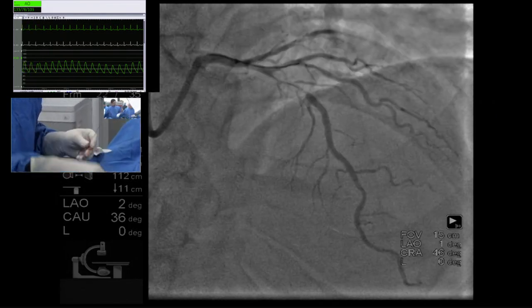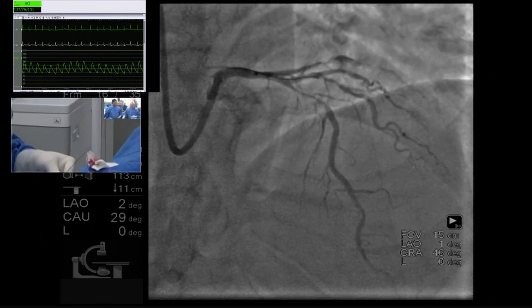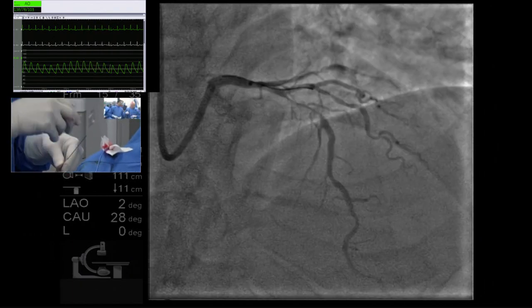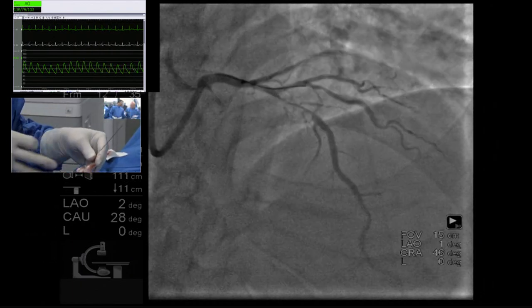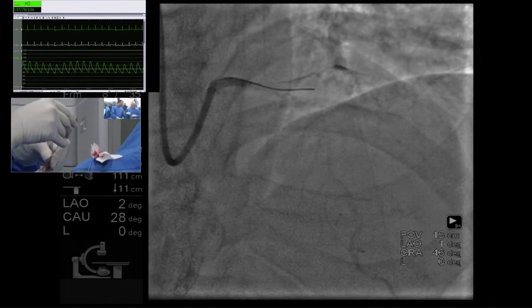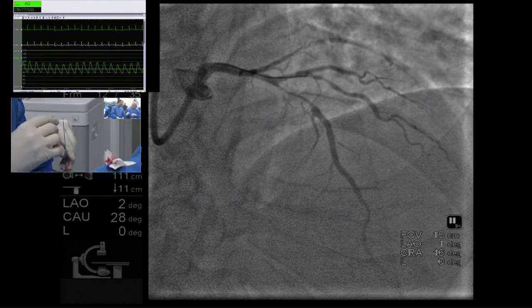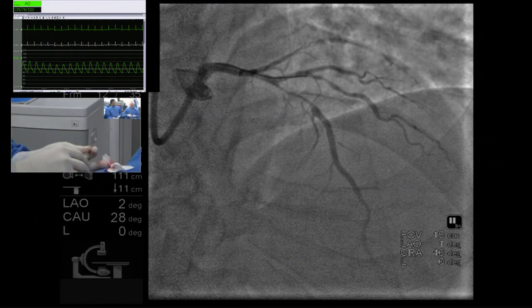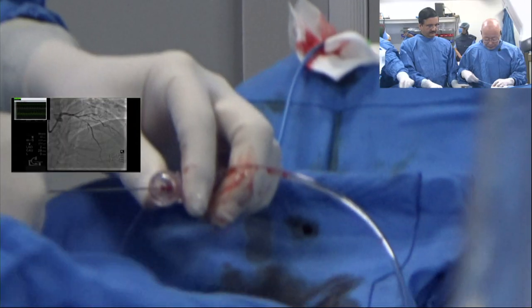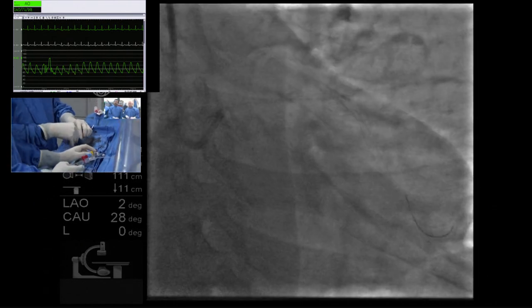though the point that was made earlier, which is that there's proximal LAD disease that comes back into the left main, is certainly well taken. My approach to this type of case, after getting wire access to all of the major vasculature, would probably be to create flow, because there's no doubt that the LAD is tight, but then do an imaging run to figure out not only what my stent strategy is going to be from the perspective of plaque preparation, plaque type, proximal and distal landing zones, but whether or not there is a place to land within the LAD.